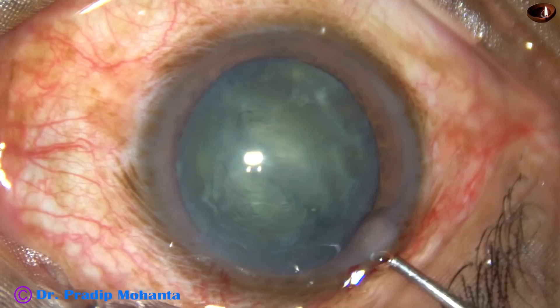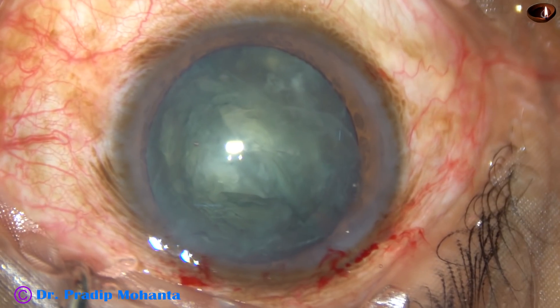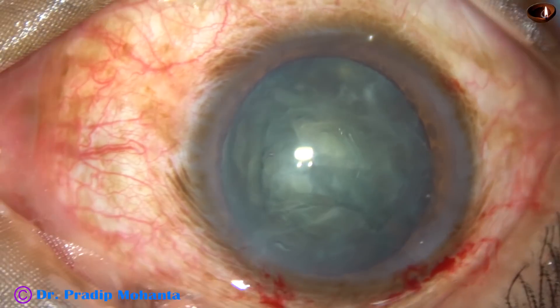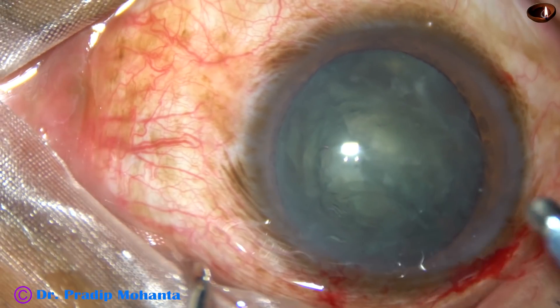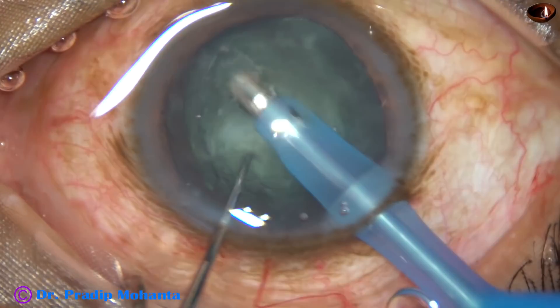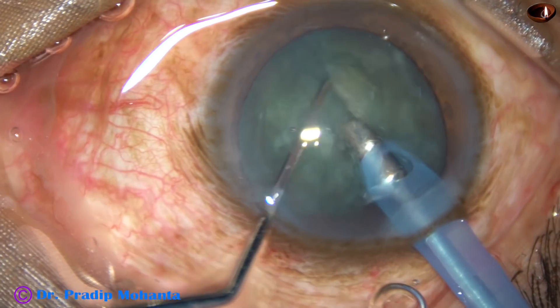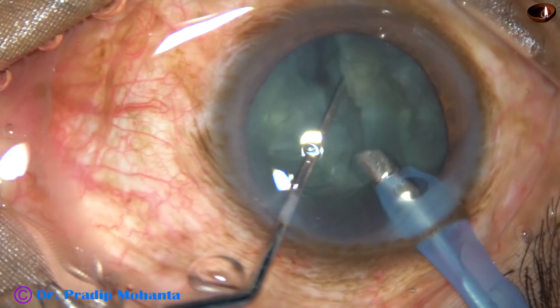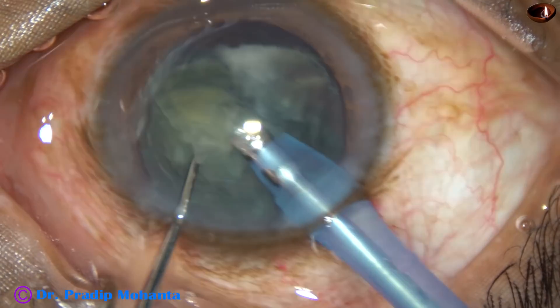Some more visco is injected. The tip of the FACO handpiece is introduced into the anterior chamber, bevel down. Some cortical lens matter is removed. Now the tip turns to the right side and the hemi-nucleus floats.